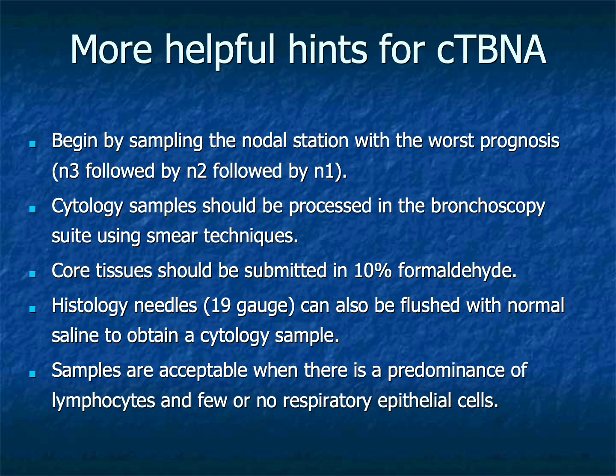Sampling strategy also matters. When staging lung cancer, for example, nodal stations associated with a potentially highest stage of disease should generally be sampled first. Sampling thus proceeds from the highest stage to the lowest stage nodal stations to minimize needle contamination and reduce the risk of false positive nodal staging.